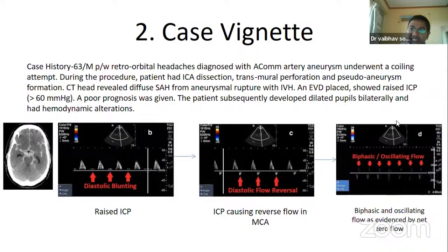So this TCD picture and these findings will help in diagnosing the patient as brain dead.